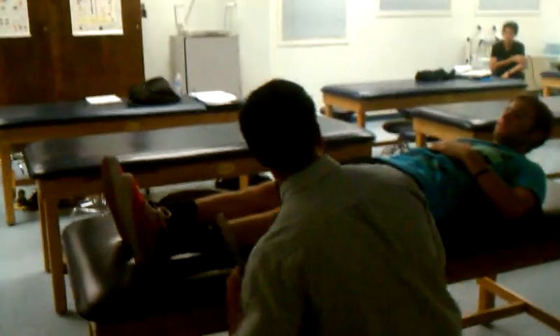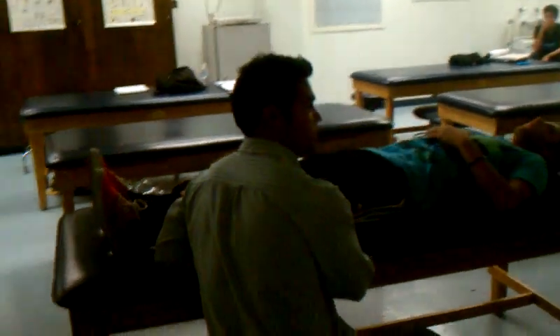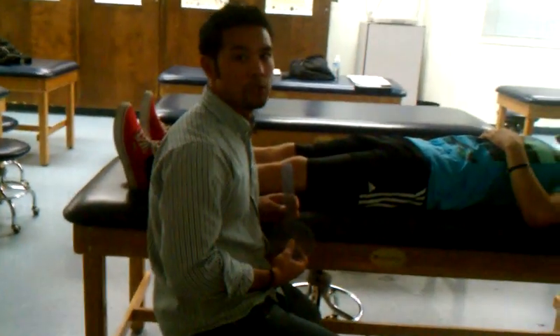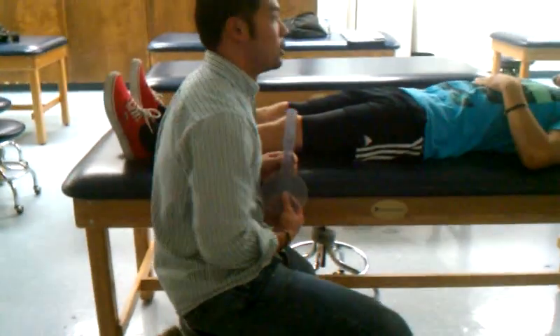Then we're going to measure knee flexion and extension. How much knee extension should we have? Zero is the norm — some people are able to go deeper. Am I able to measure knee flexion like this? No.